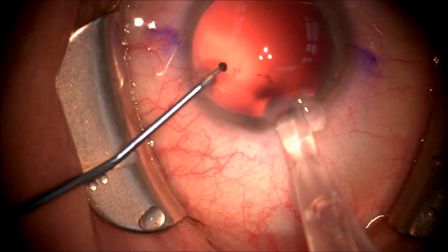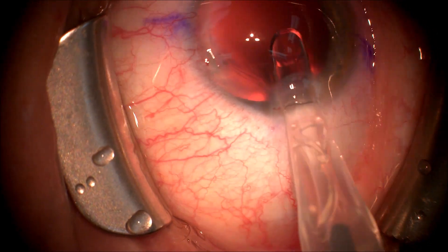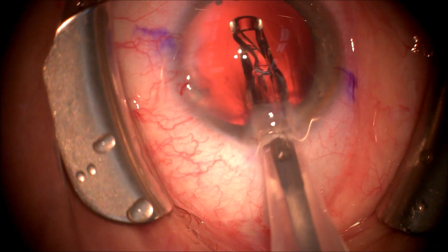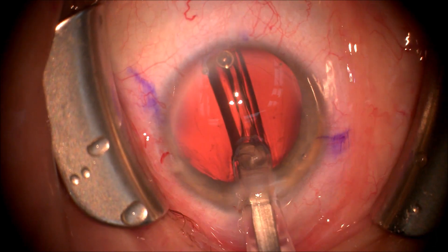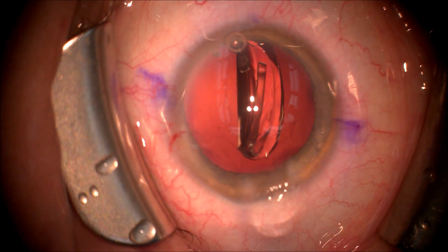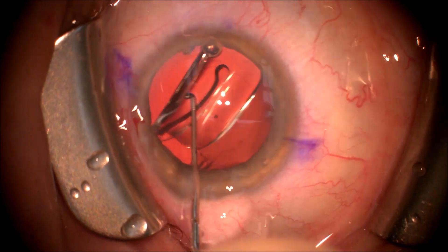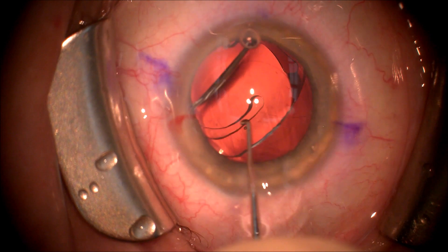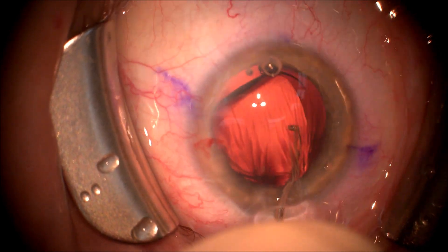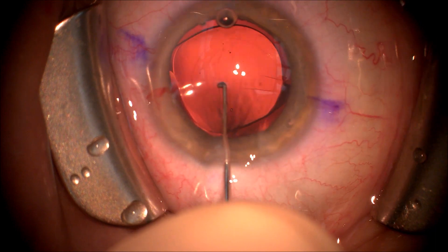We filled the anterior chamber with a cohesive viscoelastic and are going to inject the new Vividity intraocular lens implant — a one-piece acrylic six millimeter optic lens — into the capsular bag. We're going to confirm its position using a Sinski hook to make sure the lens is under the anterior capsule. This is important as it will decrease the chance of uveitis-glaucoma-hyphema syndrome later in the patient's post-operative course.